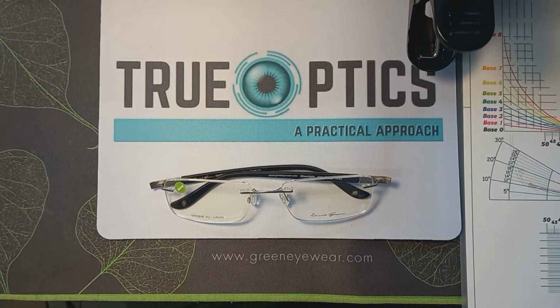Today's video is going to be an extension of my previous video where I explained the difference between your frame PD and your patient PD. Today I'm going to show you how to mark those coordinates on the actual frame that your patient has chosen for themselves, so that you can have a visual reference of the difference between your frame PD and your patient PD. For today, you're going to need a good permanent marker and also a markup chart.